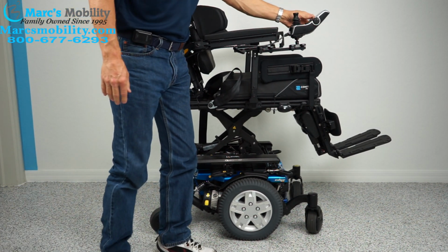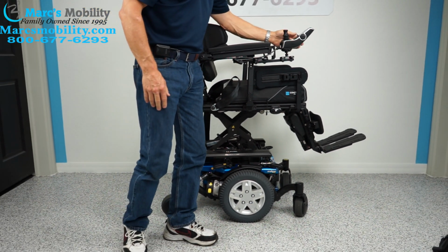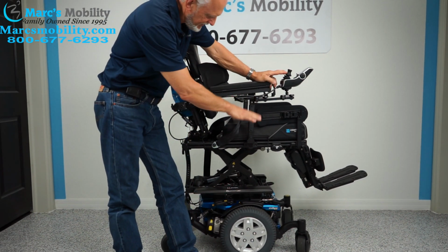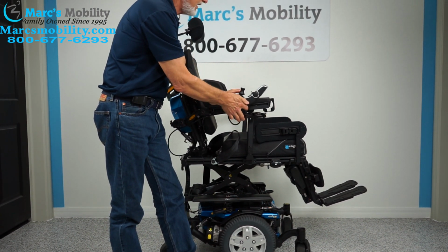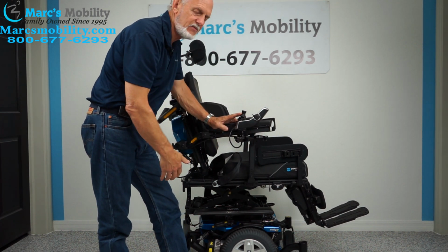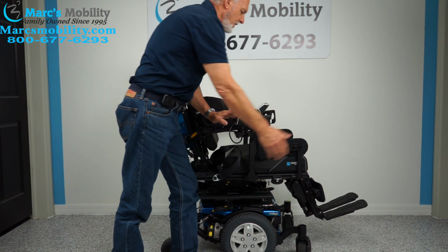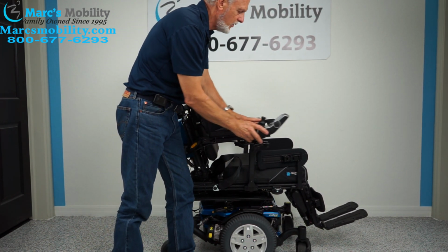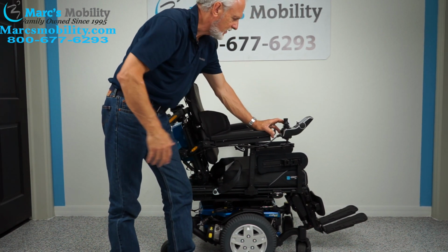So I'm going to turn the power back on. And I'm going to bring the seat back down. So as the seat's going down right now, we're going to talk about the joystick. This is a Swing Away Joystick. So you can swing the joystick away from the front. So you went from here to here. So you just got 9 inches of more space. So if you need to get to a dining table, it's a good thing to have a Swing Away joystick. If you're left-handed, we can put the joystick on the left side and it'll swing to the left side, okay?